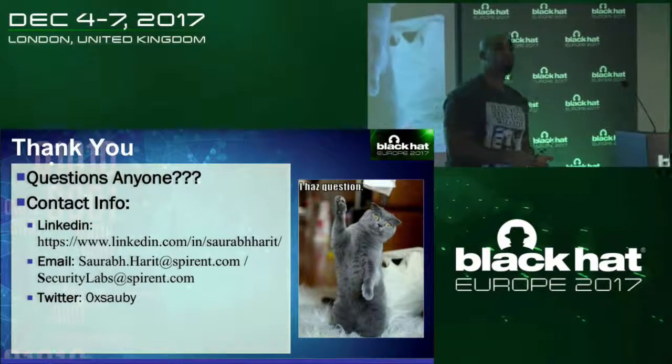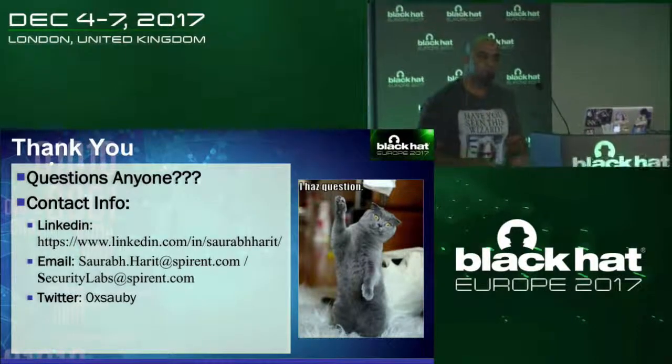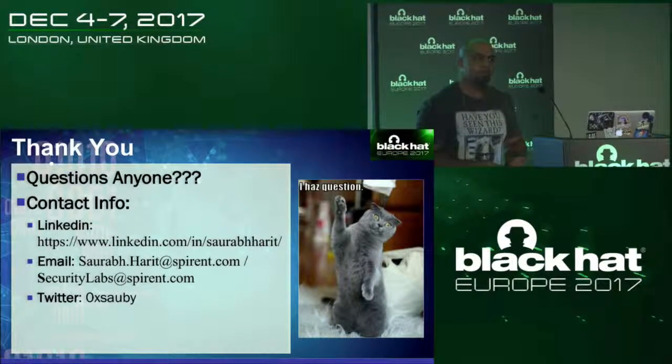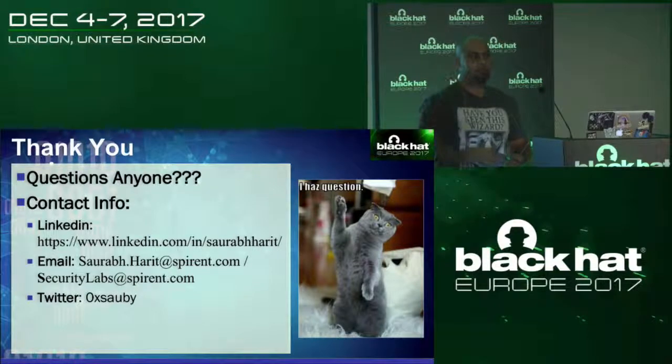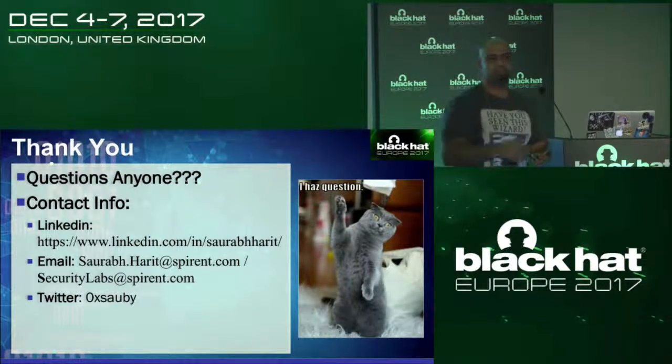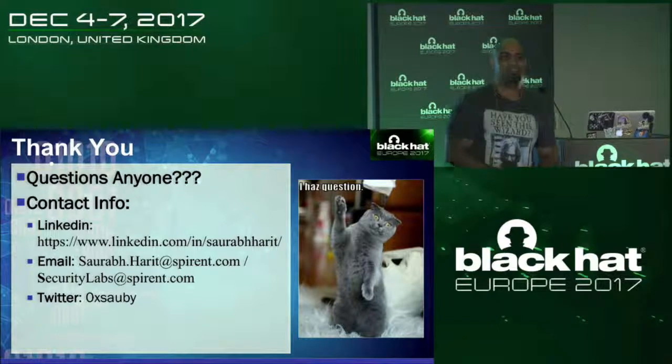Thanks for the great presentation. I'm curious, what type of encryption was used in your case study number 1? It was a proprietary encryption protocol, so we had to reverse engineer the logic of the encryption. It was all reversible, so it wasn't anything fancy, but it was proprietary encryption. Okay, no crypto keys or something like this? Yeah, the key was also stored in there. So static keys. We found the code, reverse engineered the logic of it, and then looked for the key which was also in there that was used to encrypt the data. Looks like 90s security. No, actually it looks very 2016 and 2017.